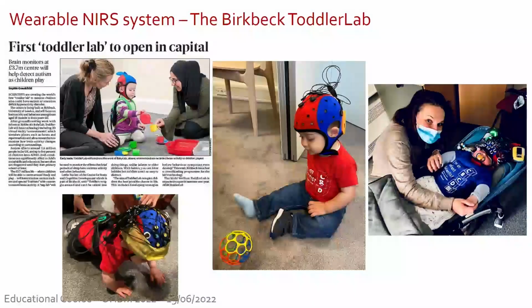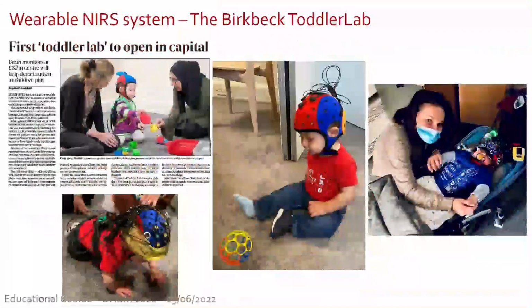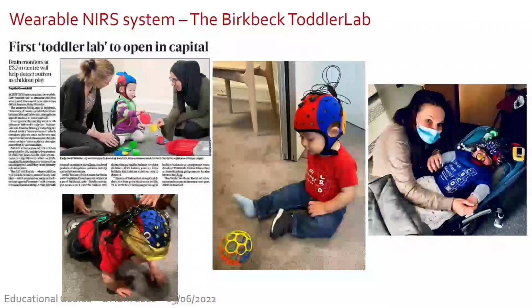This is my child, who has of course been used a lot as a participant in my lab. So at Birkbeck, we just opened the toddler lab, a lab that has been completely developed to be at the toddler's level, to study toddlers. And we've been lucky enough to have this new wearable system where infants and toddlers can literally just walk around. They don't really mind. They're fine with that. They play. They can be themselves, literally.